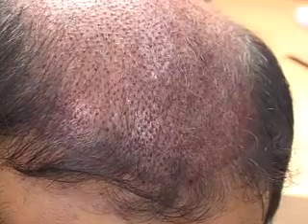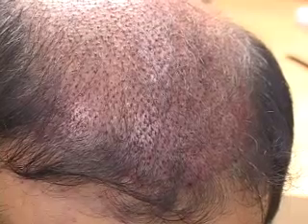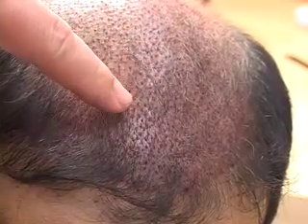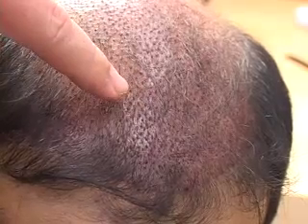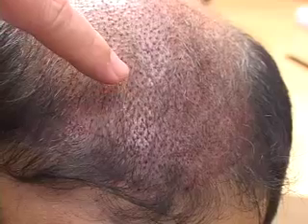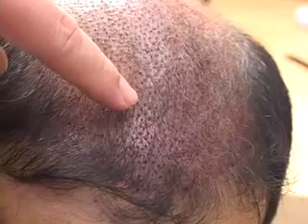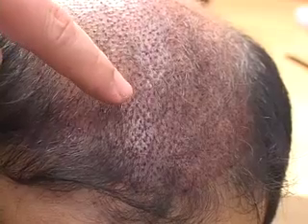What you're looking at right now are a significant number of grafts — close to about 2,000 grafts here. These are called multiple unit grafts. They're equal to about two standard grafts that another surgeon would place in. They provide an incredible amount of density for this gentleman, and also, they maintain absolutely equal spacing of normal follicular units.